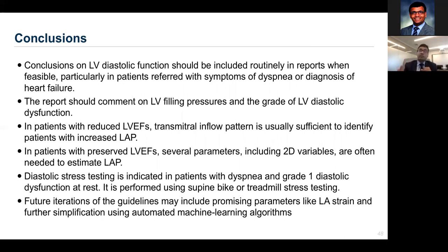And since there is more and more importance to the filling pressure, because that's the one factor that you can treat or manage in patients with heart failure, the guidelines stress upon variables that will look into the presence of elevated filling pressure or absence of elevated filling pressure. The elevated filling pressure and the grading of the LV diastolic dysfunction should be commented upon, therefore.